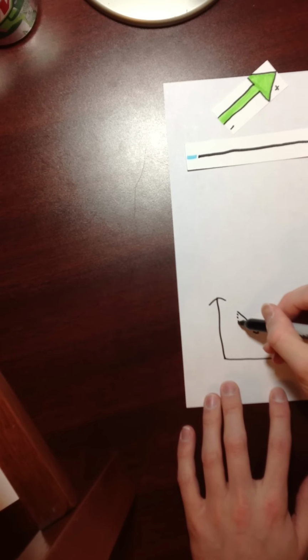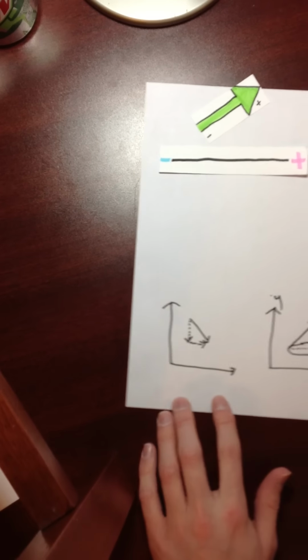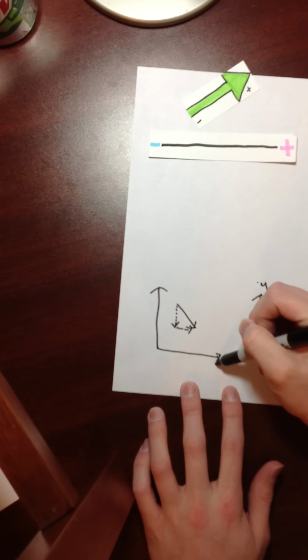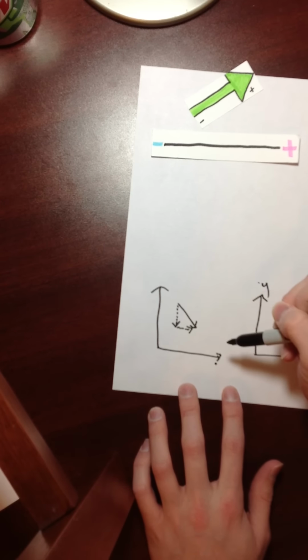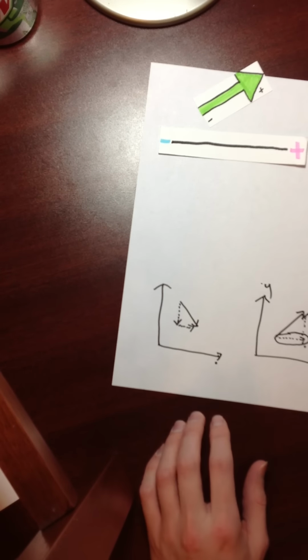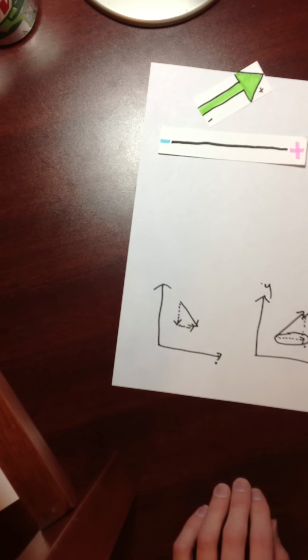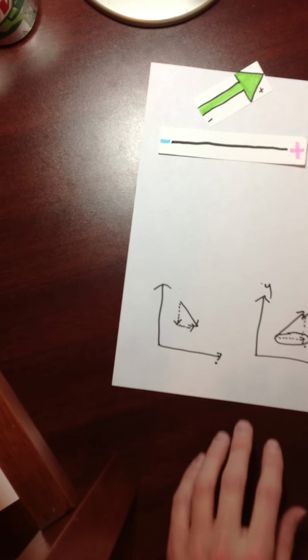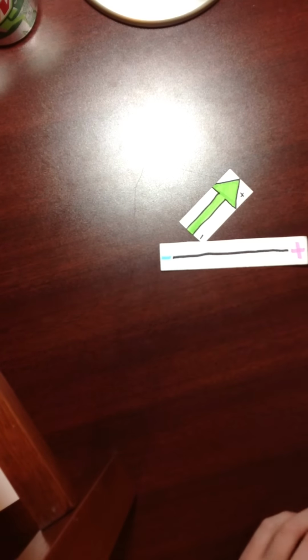If I break this up into vectors, or components rather, this vector in comparison to the x-axis would show positive. However, when I compare this with the y-axis, it's actually negative. This is the reason why we can see in, let's say, lead 1 a positive deflection, but yet in AVL it's negative. We'll talk about that more in a moment.